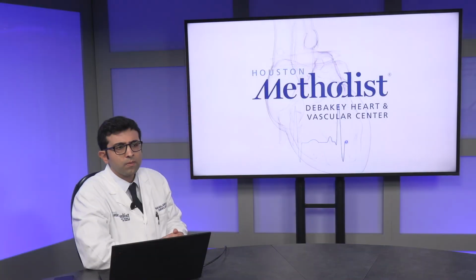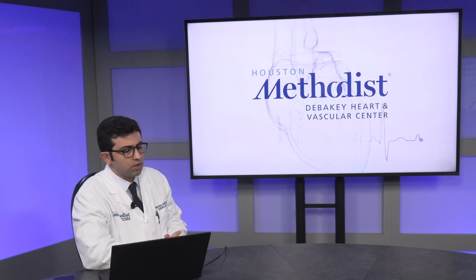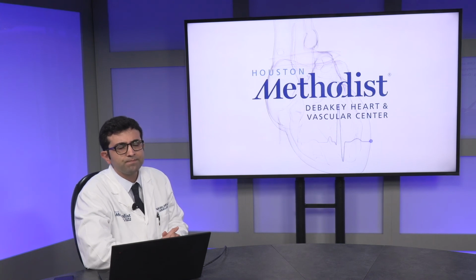Yeah, the mitral valve leaflet borders, because that often presents an issue with trying to get the volumes correct around the bases. Yeah, no, I haven't seen any. I think a lot of these intricate details, and as you all know, folks, for example, with mitral valve prolapse, folks with pseudoaneurysm, a lot of these complicated patients, it's going to be a lot of manual adjustment. But I'm not aware of anything automated to try to detect the valve plane. No. Thank you, Maan. Yep.